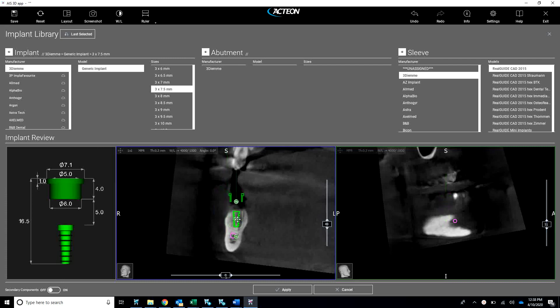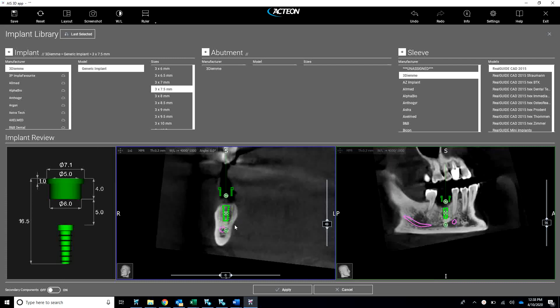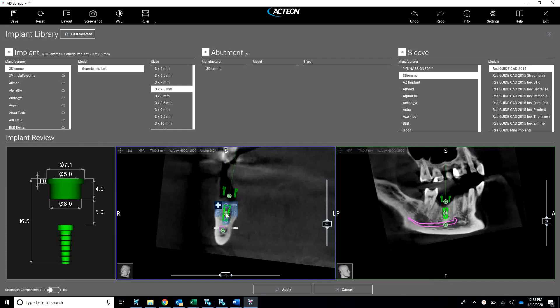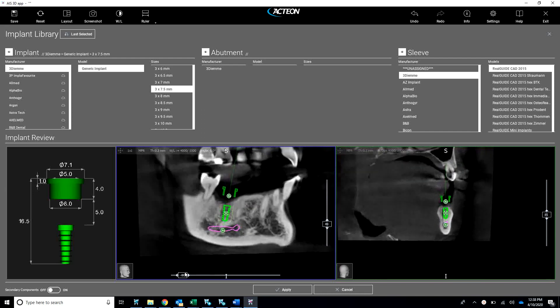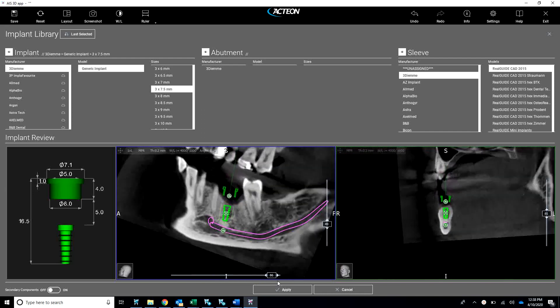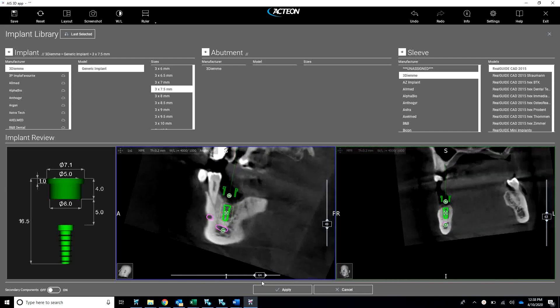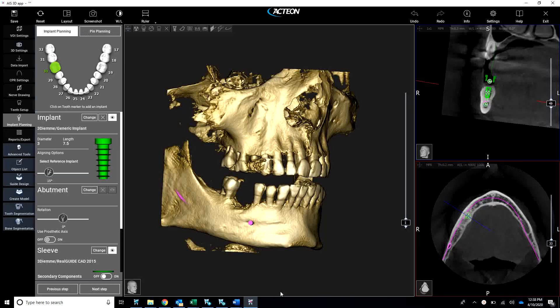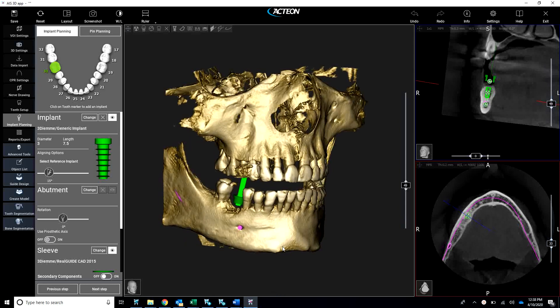We're going to adjust this implant — we're going to angulate it and get that nice and centered up in the bone. You can go down here to the bottom and see a 360-degree view of that implant to make sure it's got the right angulation and placement. Looks good. We're going to go to apply. Dropped in the implant right there.